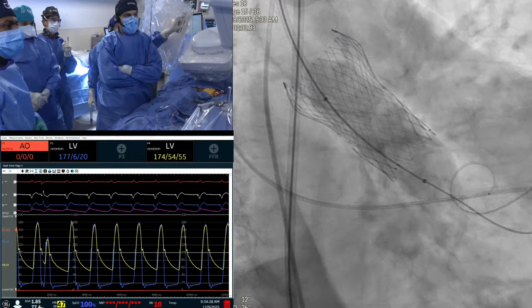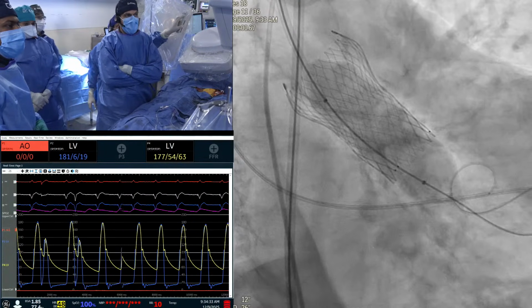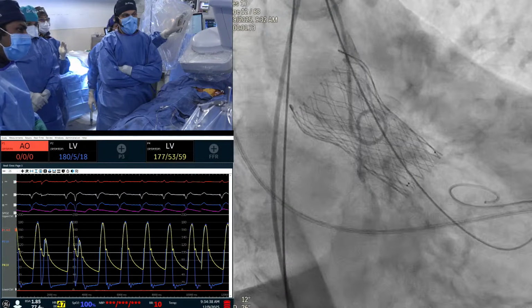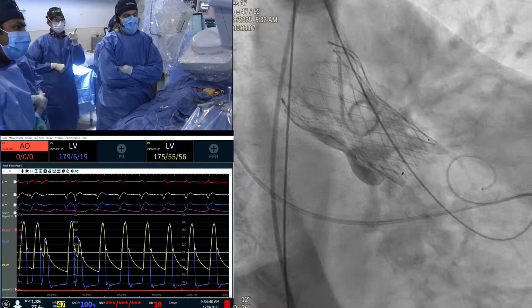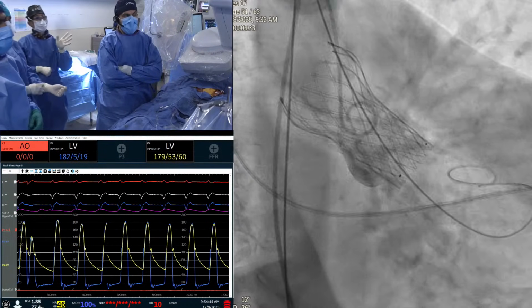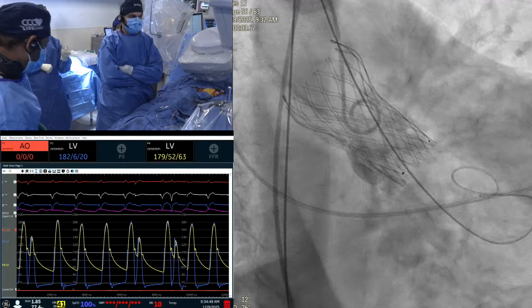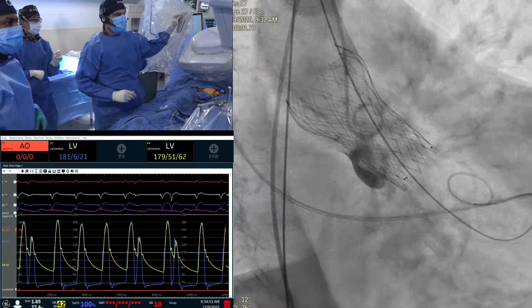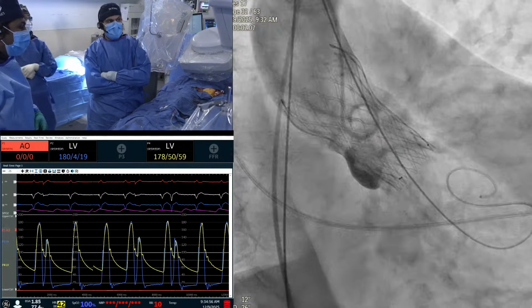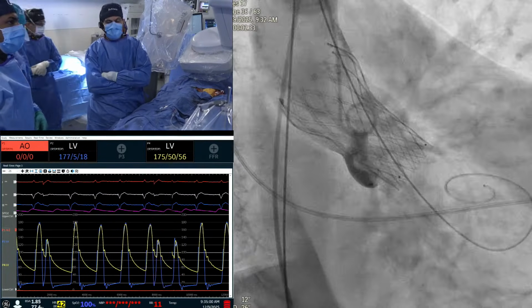Now look at how you post-dilate, and how much it expands. You see that it might foreshorten a little bit on inflow. So if you only have 1 to 2 millimeters of depth, be very careful when you post-dilate, because it might move up further. You can see before and after how much it expands. There's not much PVL, but we post-dilate because of the frame expansion. On a 21 true average diameter, you see how much the actual frame expands. Clearly, before you expand, it's not 21 millimeters.